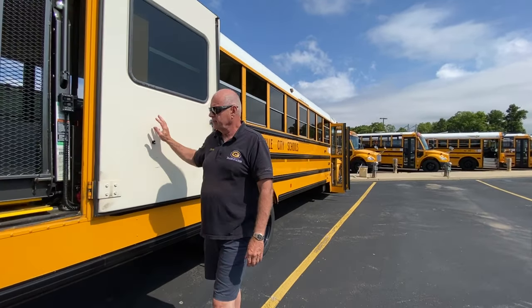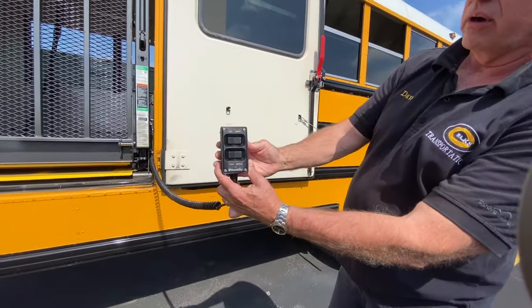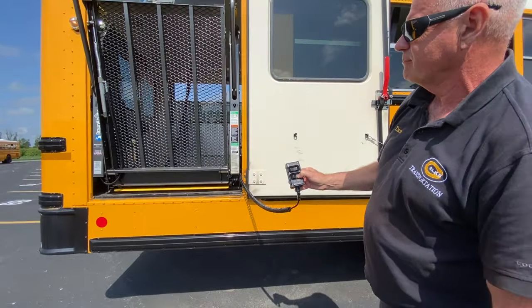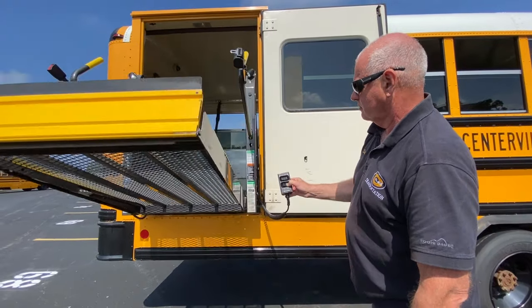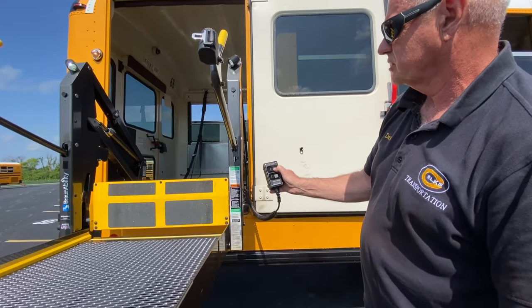After that, we bring the lift down — that could be the driver or the aid that does that. On the device, we're going to unfold it first. It'll come out in one continuous motion and stop, come all the way out and stop. Then we're going to come all the way down, and it will stop.